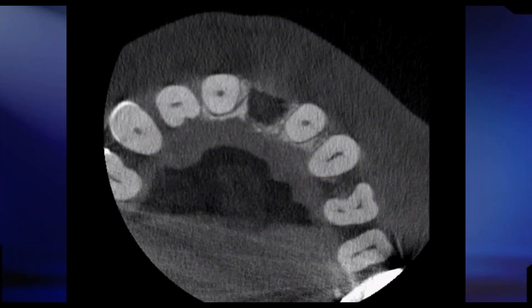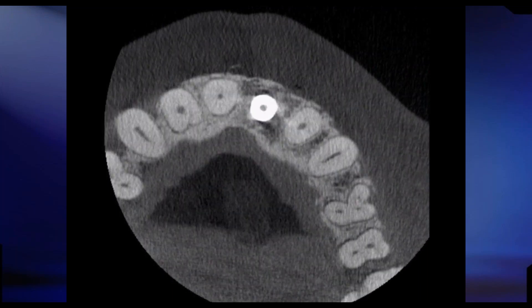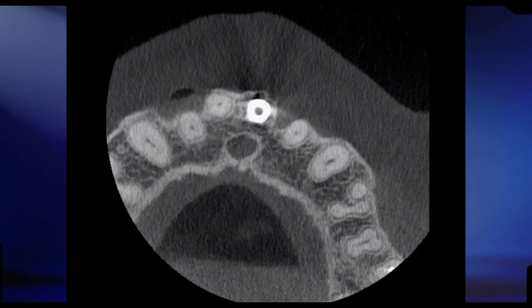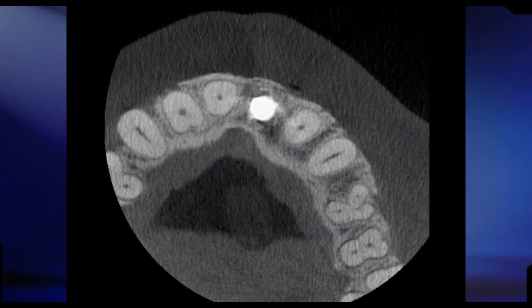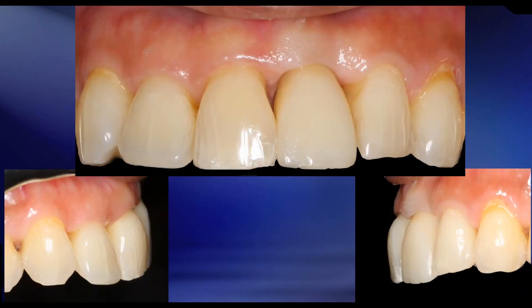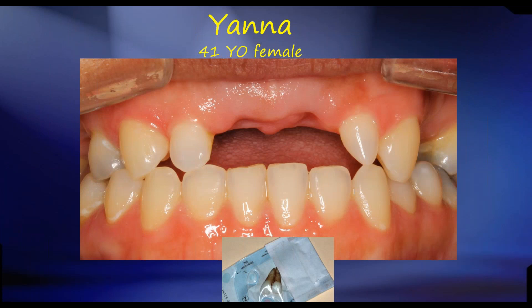The nice thing about doing this is we can see the result immediately. Looking at the axial slices going through the different layers, you can see this would have been a difficult case to do without guided surgery — there's a natural concavity on the buccal/facial and the incisive canal to deal with — yet we're able to do this with a very high level of predictability. With a surgical guide fabricated in office for a total cost of less than about $20, we're able to precisely place an implant. Here's the final screw-retained restoration. We did get a little bit of tissue recession, which we knew would happen because of all the inflammation, but the patient was very happy.